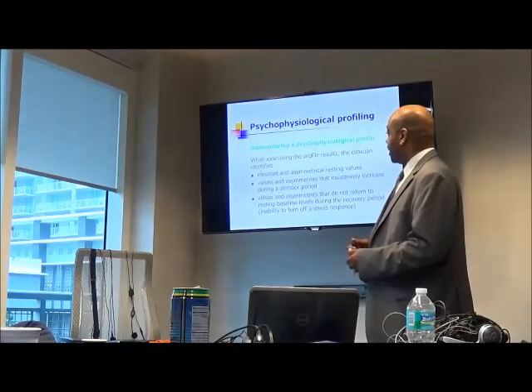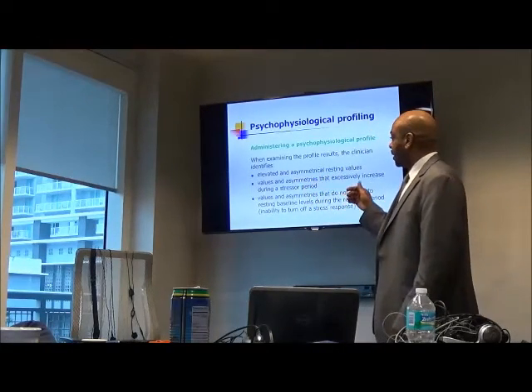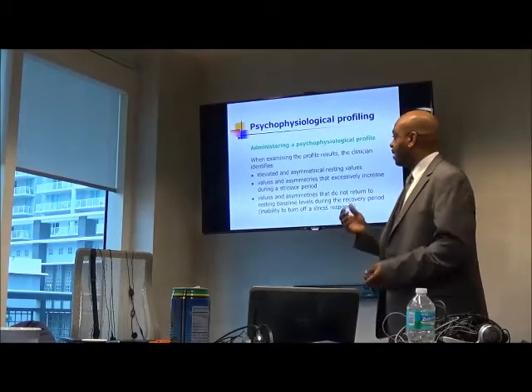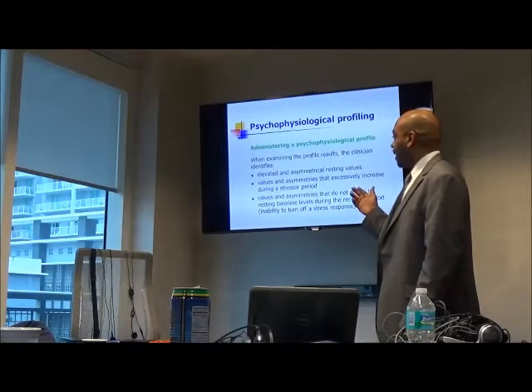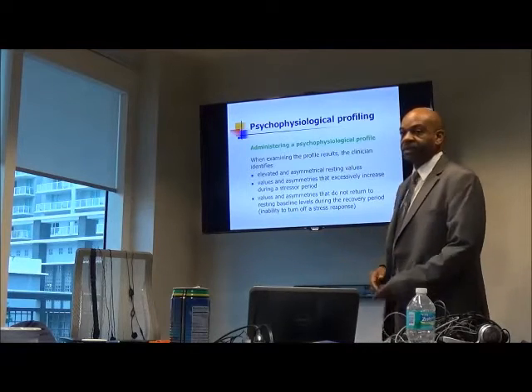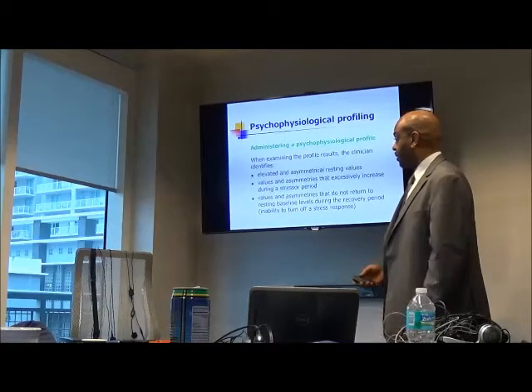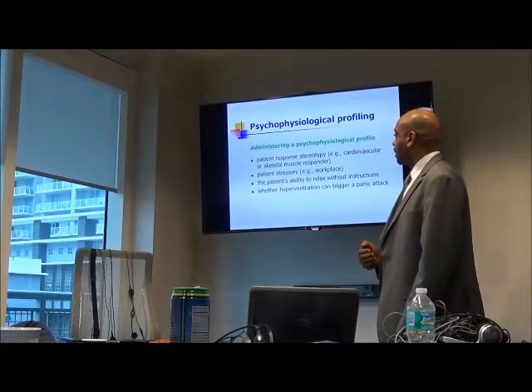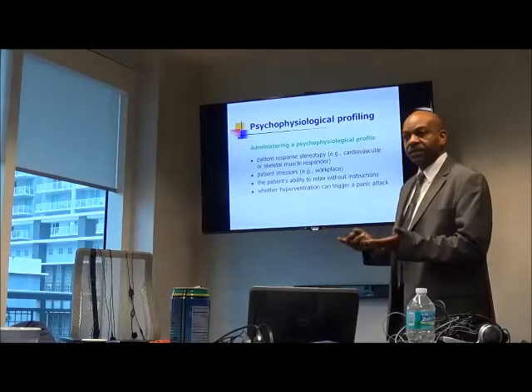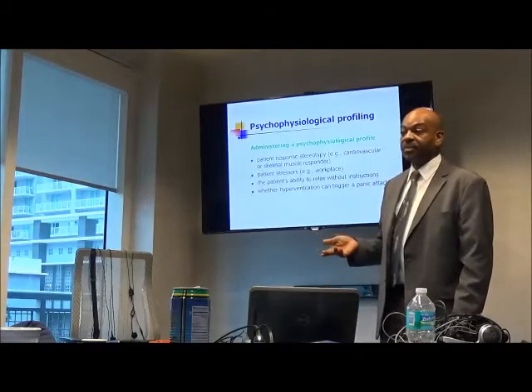Let's see here. So you are looking to see if you have any elevated readings, if there are any asymmetries. So if you're measuring left and right side, is the right side higher, or those kinds of things. And does it change more during stress? And also, does it return to baseline? So again, it's important, does it return to baseline? Not only how much is there a change to begin with. Then this is important to see what system or which physiological signal is changing, and is it related to the symptoms that they're coming in for.